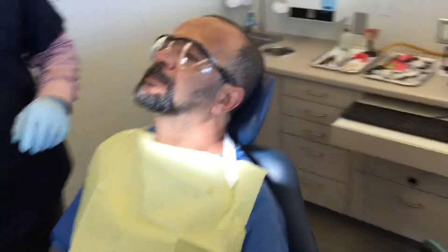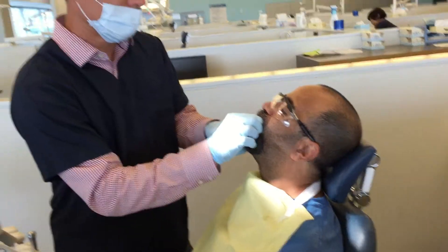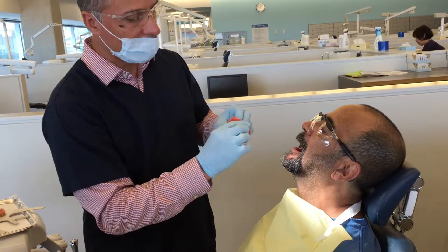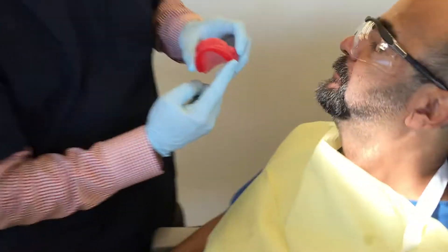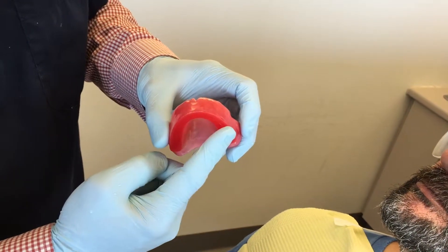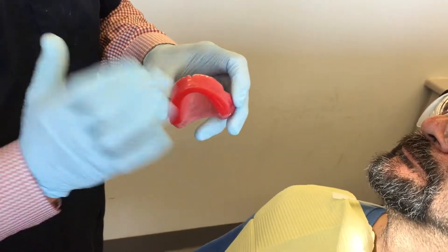The way I've started out with this bite block, it's an estimated length and width where we're going to start. I need to build it up here a little bit, so we're going to take a little time to build this up with some wax. I'm going to re-contour it to have a nice flat surface and then we'll check again with the Foxplane.